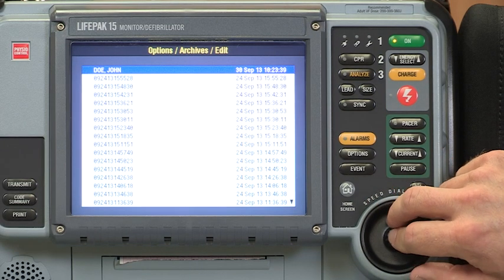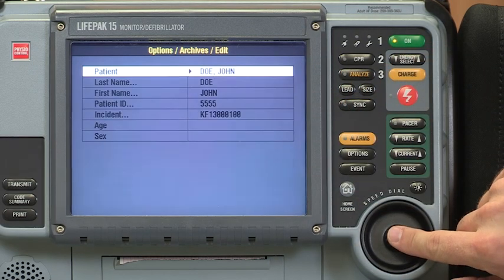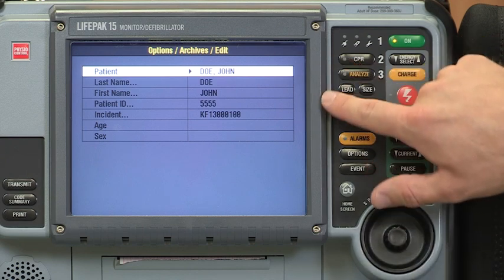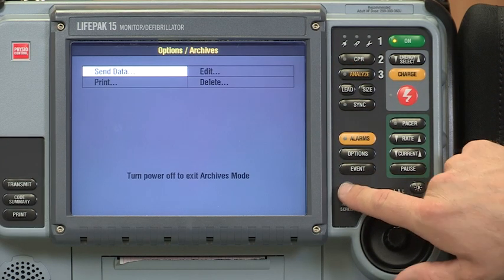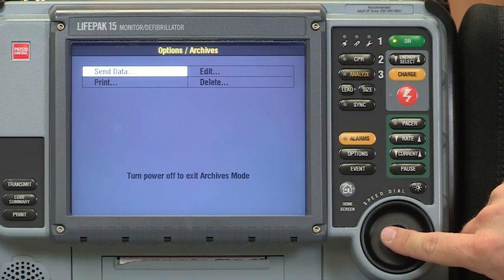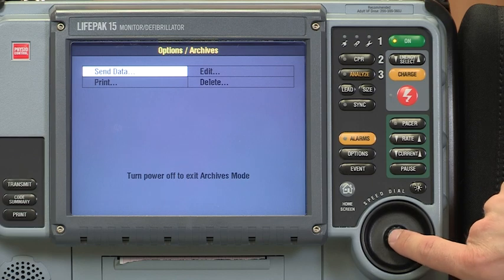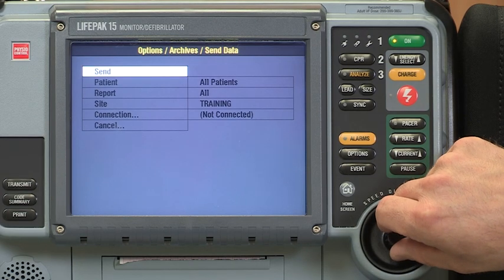Select patient. Be sure that we see that it matches our time. Go ahead and select them again for patient archives, and then we'll hit the home screen button. It'll bring back up our options and archives menu. At this point, we do want to send data. Just push send. Push the button to select send data.